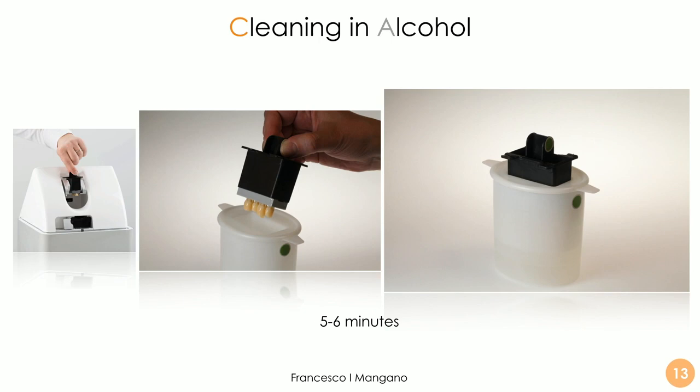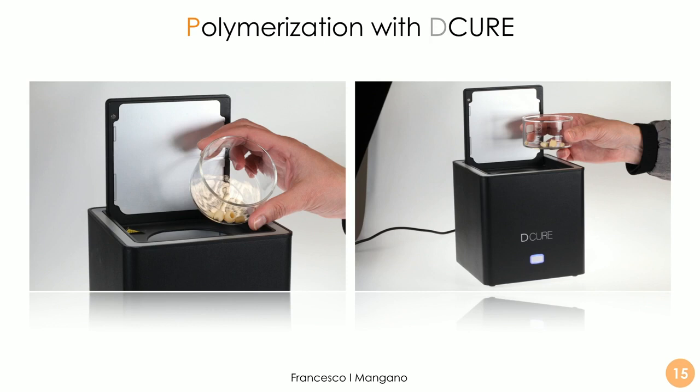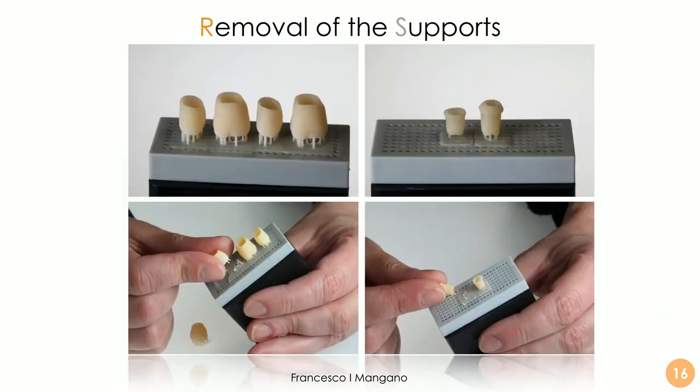We then remove the plate and place it inside the cleaning device, used for cleaning the restoration and removing excess resin. We work for 3 to 5 minutes in alcohol to remove the resin excess. When everything is perfectly clean, we proceed to the final characterization and polymerization in the dedicated Décure device. We then remove the restorations from their supports and place them into the Décure. Easy removal is granted by the technology implemented by DFAB and DWS.